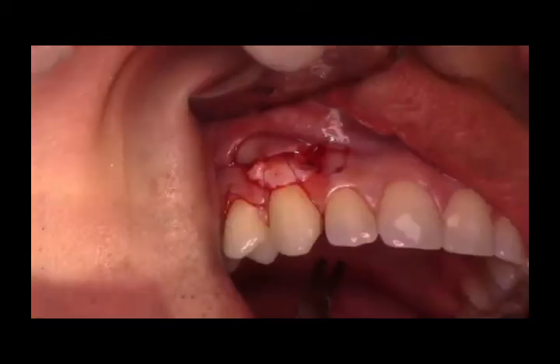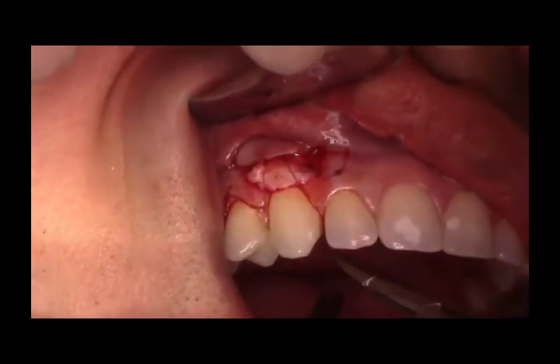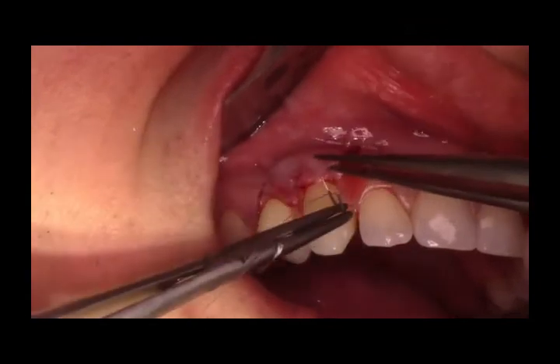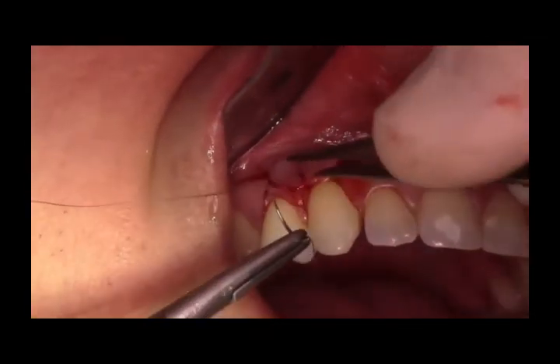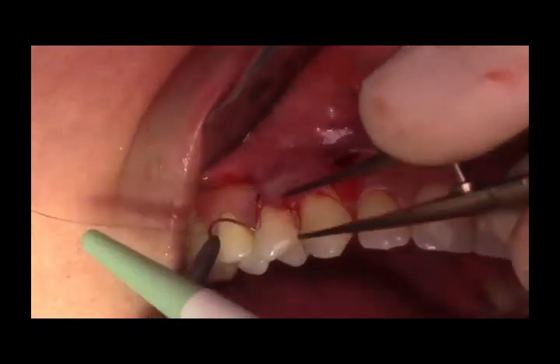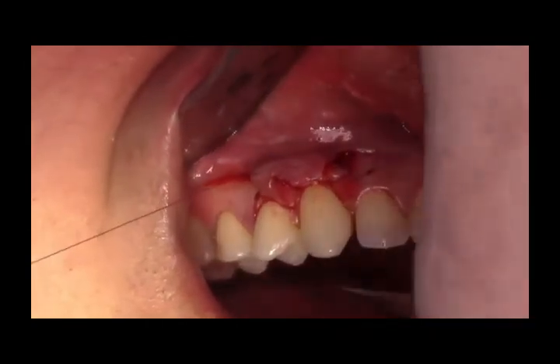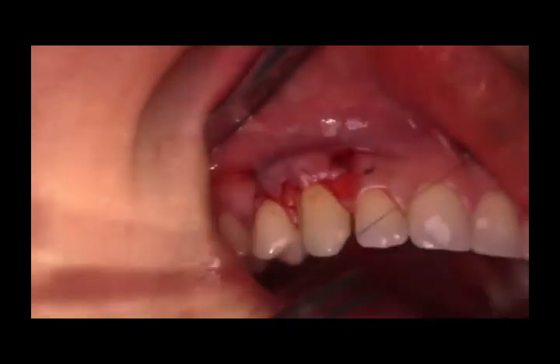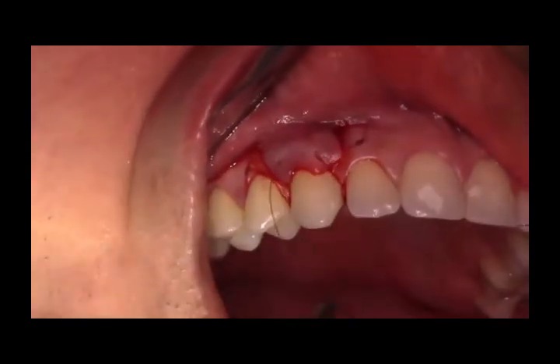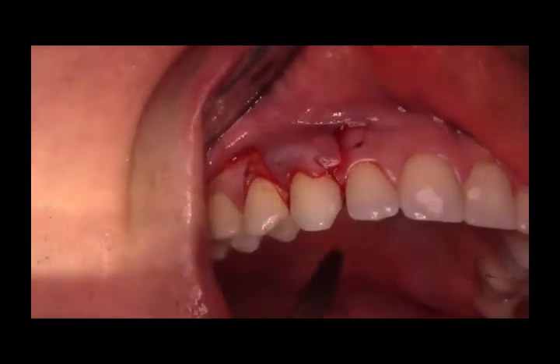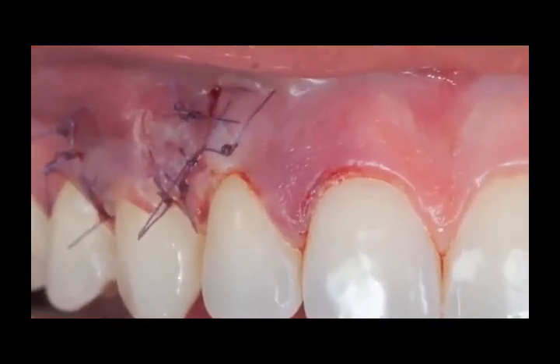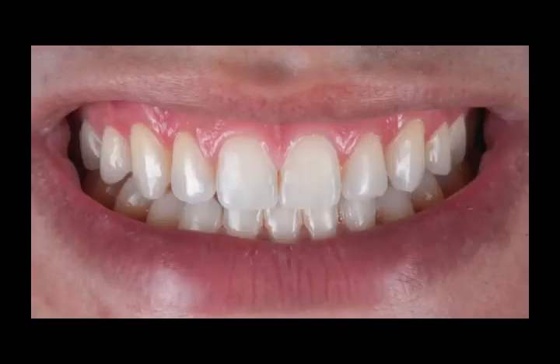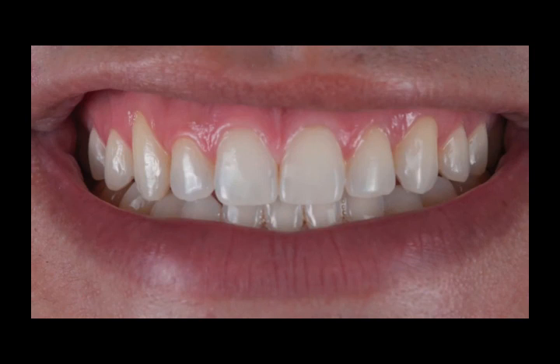The flap is then coronally advanced and stabilized in position with the help of sling sutures. This is the post-operative view immediately after surgery, and this is the post-operative view after a few months. The pre-operative view shows the condition with which the patient initially presented.